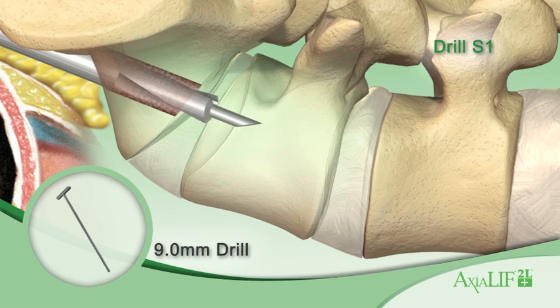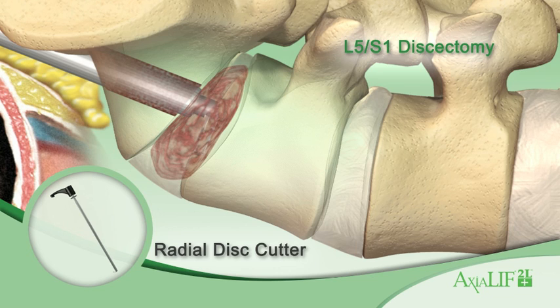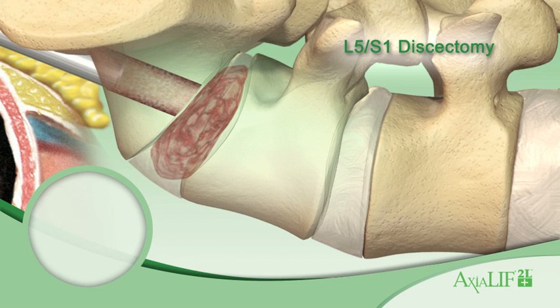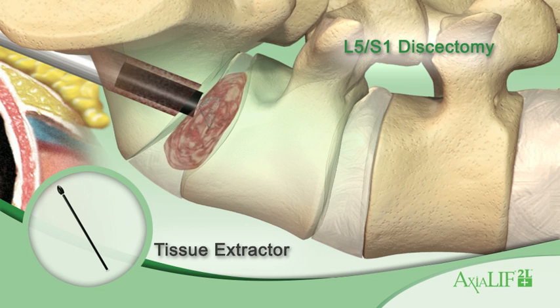Drill into the L5-S1 disc space with the 9 mm cannulated drill. Prepare the disc space with a series of nitinol disc cutters and endplate rasps, varying in length and cutting actions. Each of the 4 cutters and rasps are designed to debulk the nucleus pulposus and lightly abrade the vertebral endplates circumferentially up to the 3 cm footprint, while creating a bleeding bed for fusion. Use the tissue extractors between the 4 cutters to extract the diseased disc.